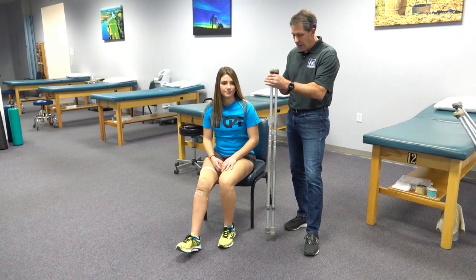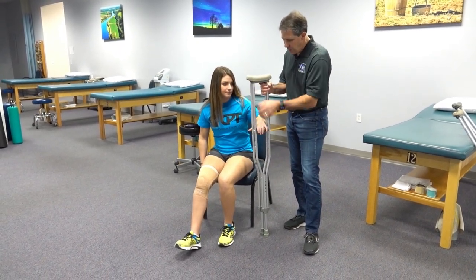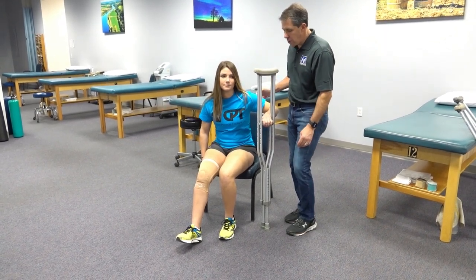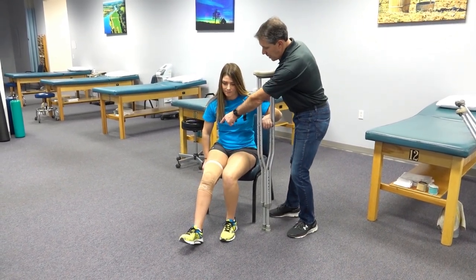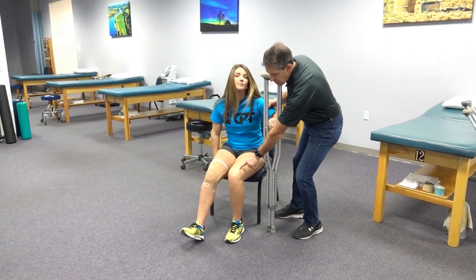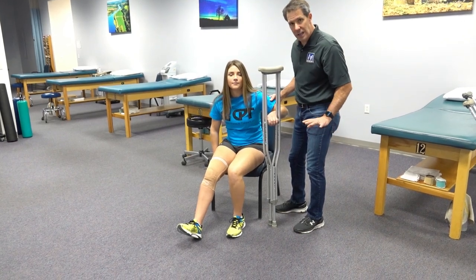What you then do is take both crutches and put them on the unaffected side, and put your hand on the hand rest just like this. Then you're going to be putting the other hand on the chair, putting most of your pressure through the good leg, keeping the other one ahead, and also putting a little pressure through this hand just to keep some balance.